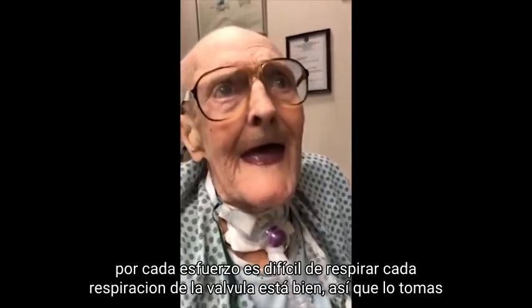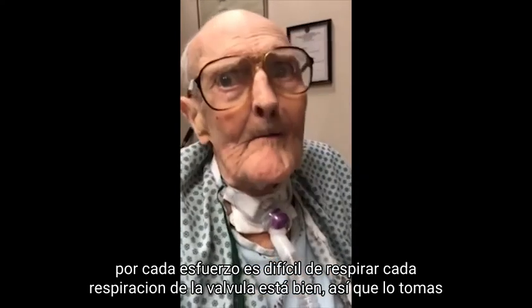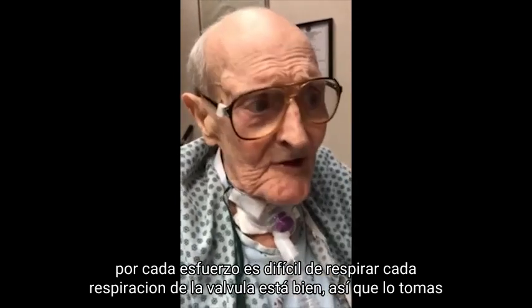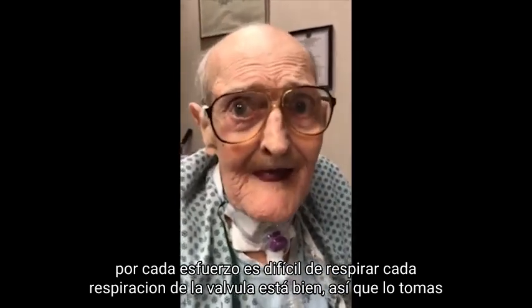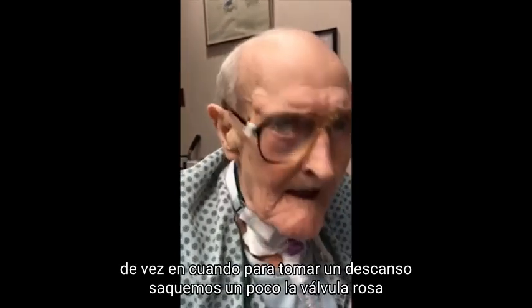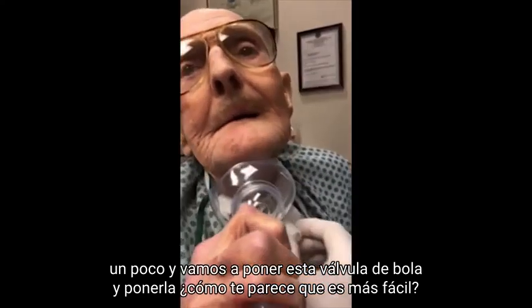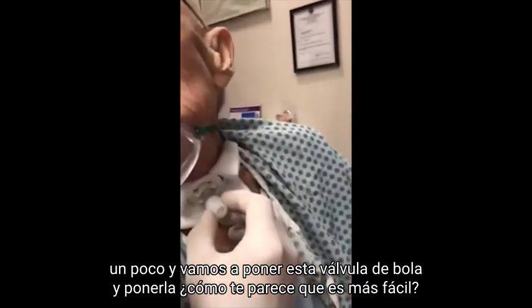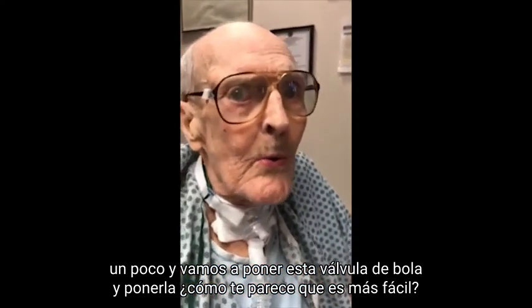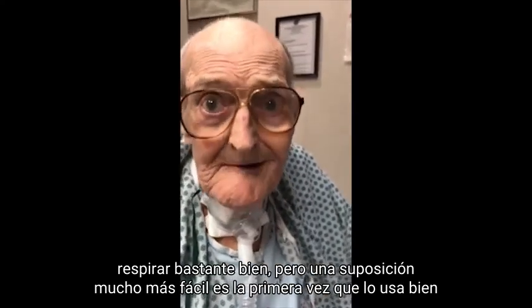When I breathe outward, it's hard to breathe out. But this one was easy. Okay, so you take it out from time to time to take a break. Let's take the pink valve out a little bit, and let's put this ball valve on. How do you feel? Is it easier to breathe? Breathing out is much easier. Much easier.